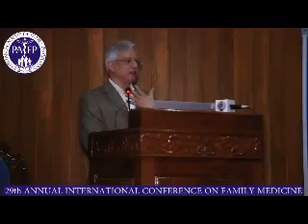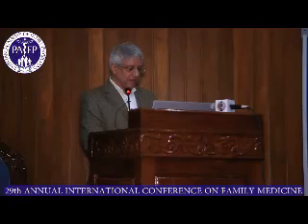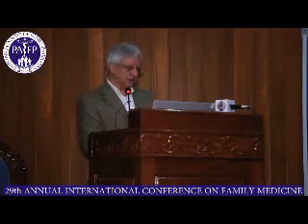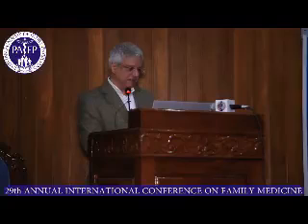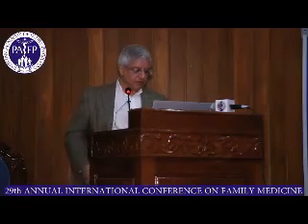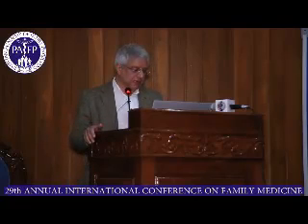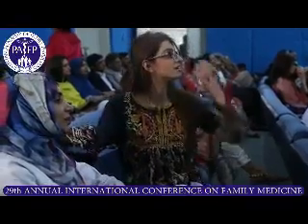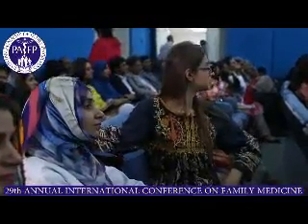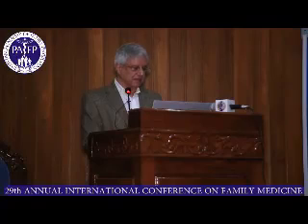Same stands true for the carotid or extracranial workup. And MR venography is much easier to do and a much more robust test with good reproducible accuracy than CT venography, but you do it in any case. And same stands true for the remaining venous assessment of the intracranial circulation. So this is how we decide upon MR versus CT, at least as far as head is concerned.